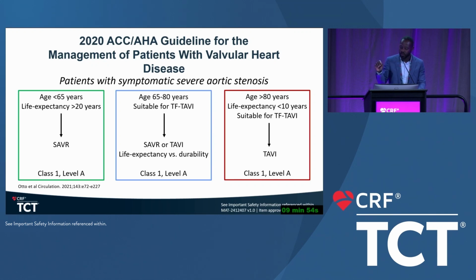So let's start with the coronary access and your question about the importance of getting a proper commissural alignment. Is it something that we should still advocate with this type of platform? Or is it something that you question from time to time, accepting some kind of misalignment in your patient?